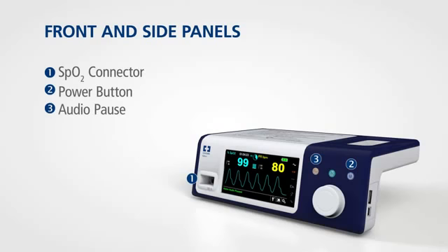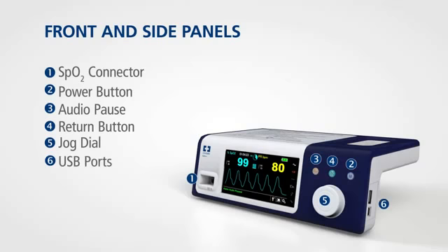Easily accessible buttons allow you to silence alarms for a set amount of time and to return to the main screen. A jog dial controls system functions. And on the side of the monitor, you'll find USB ports for data downloads and system upgrades.